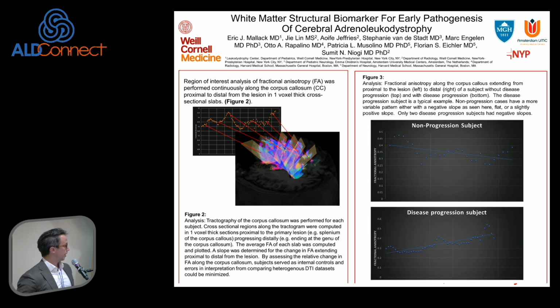I've talked a little bit about DTI work in the past, but for everybody, diffusion tensor imaging is also a way to look at local microstructure in the brain. And really, you're looking at degree of organization. And the variable that gets used most often is called fractional anisotropy. That's a long word for how organized is that little area in the brain, and that degree of organization is often governed by how well myelin is packed and organized.